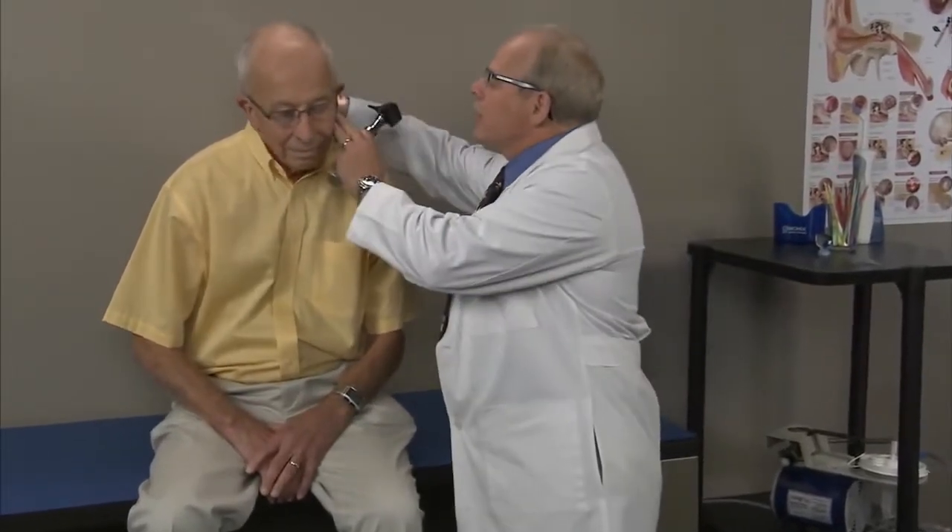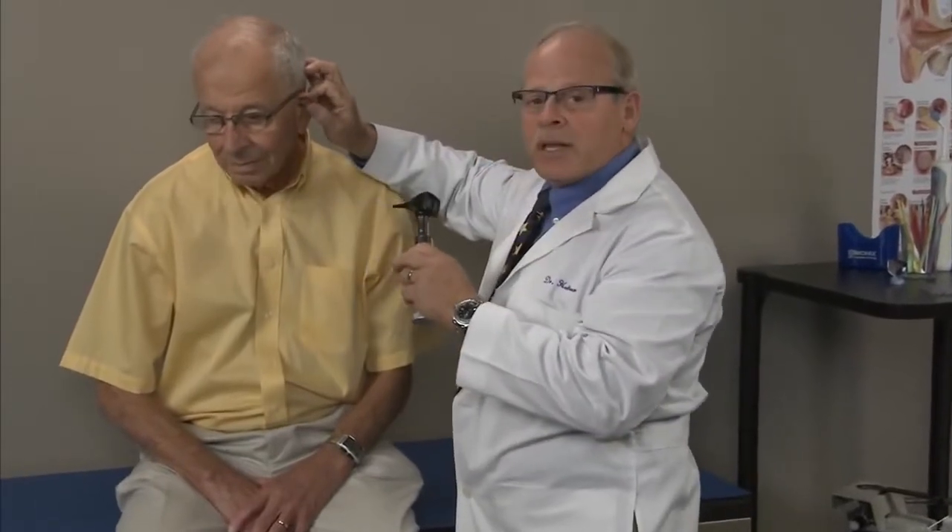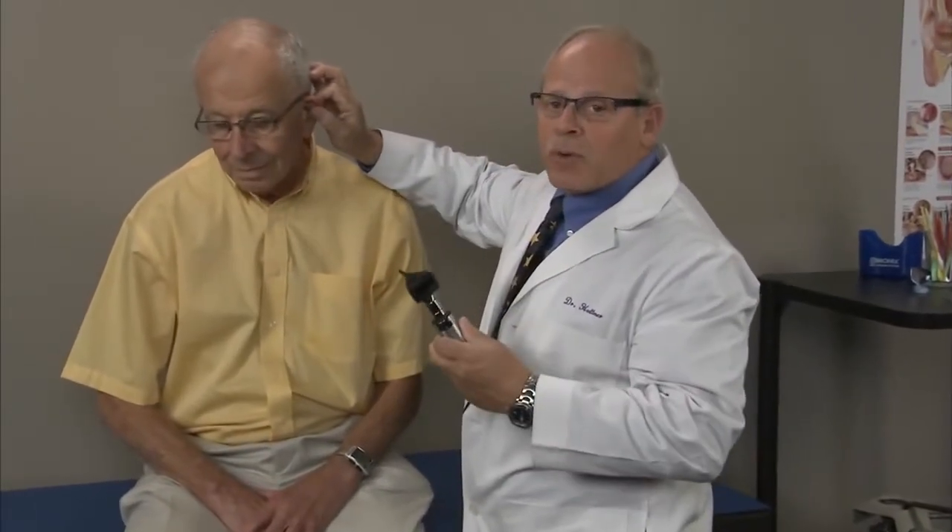For adults, I like to have them sitting on the table in a comfortable position at a good height for me. As always, we're going to use our otoscope to examine the ear canal to see if there's any wax, where the wax is, and what kind it is. I want you to turn your head a little bit, and I'm going to extend the ear canal.